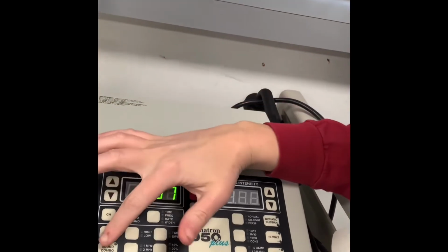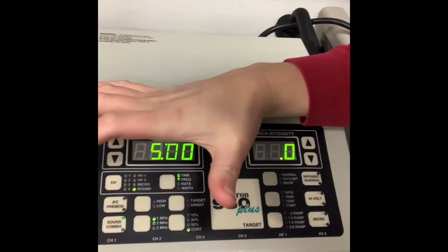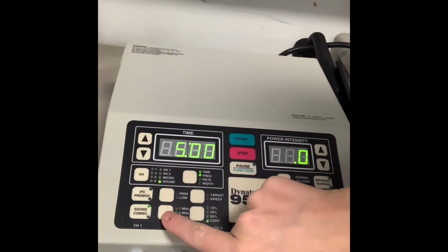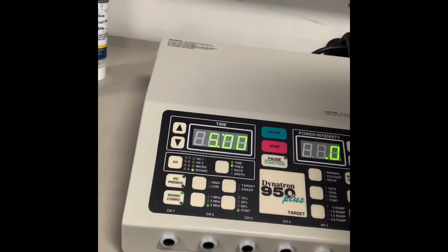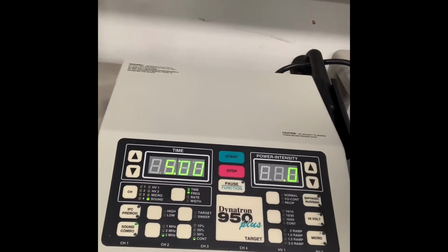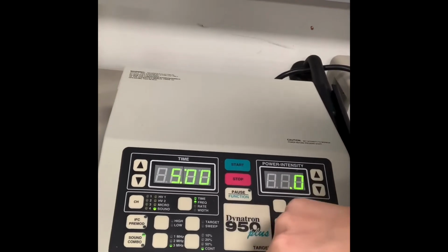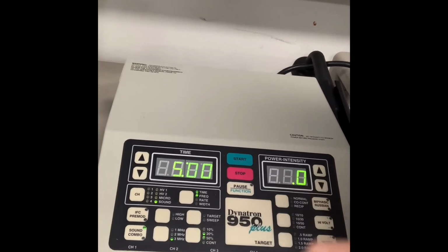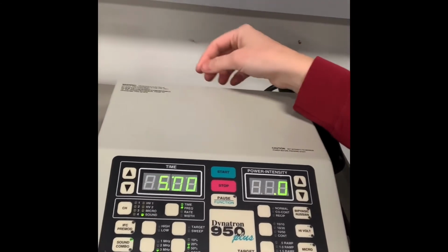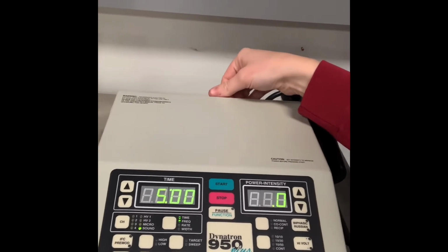And ultrasound uses sound waves to penetrate the tissue. So we're going to click on sound. And then for our frequency, we're going to choose 3 megahertz because his injury is more superficial, and the ankle has less soft tissue there to penetrate. So this will be more superficial frequency. And then we are going to use 20% for the duty cycle because we want it to be non-thermal since he is in an acute inflammatory phase and we don't want to increase the inflammation.